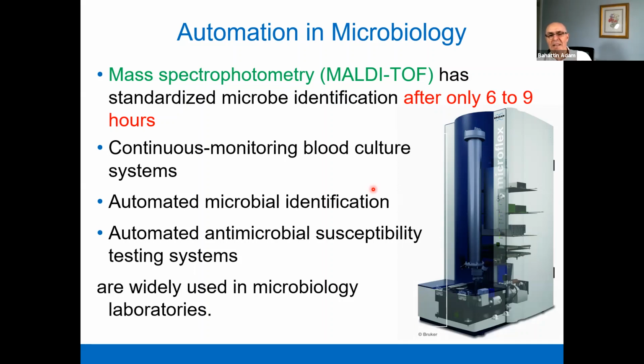It decreases the test turnaround time. Okay, you will provide the test in a short time, and as you see here, there are a few automation systems that we are nowadays using in microbiology.